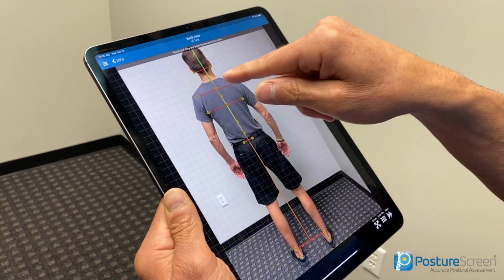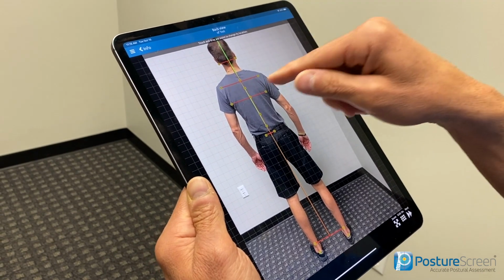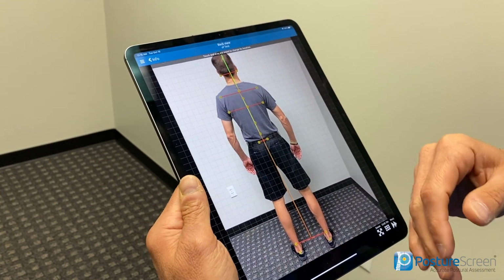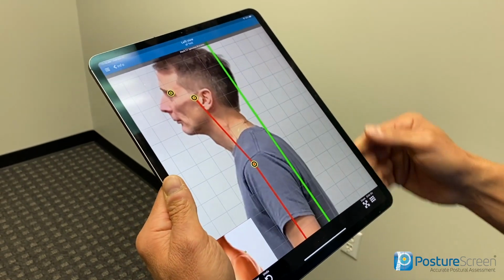The computer is going to try and hit the head of the humerus on this area from behind. If you want to keep it there, you can, or you can move it to the tops of the shoulders, as long as it looks consistent with the plane of the shoulders, and there it does. So I'm going to just go ahead and make a clinical decision to leave it that way. Move on to the next level.